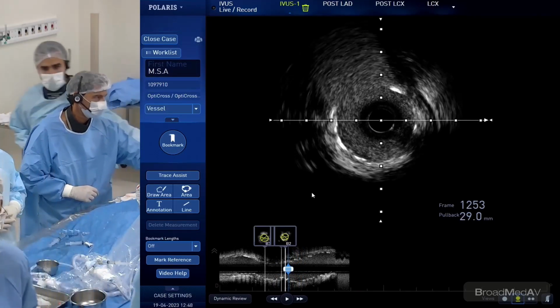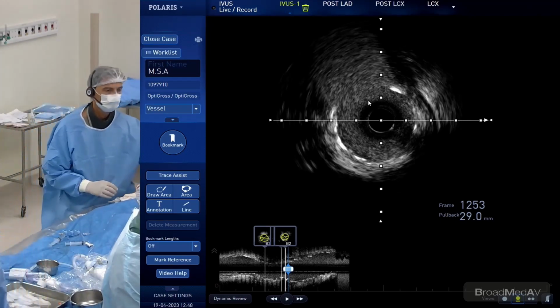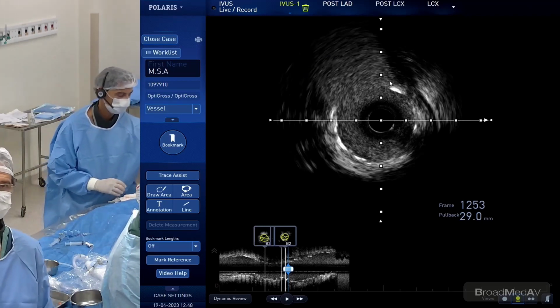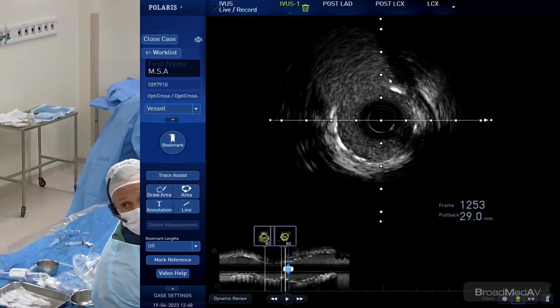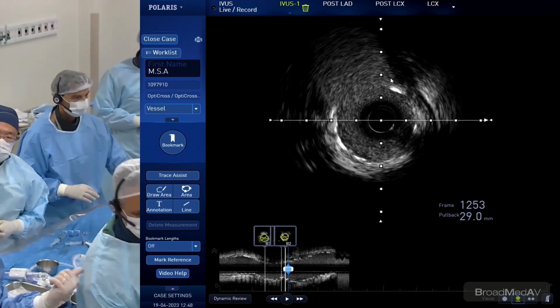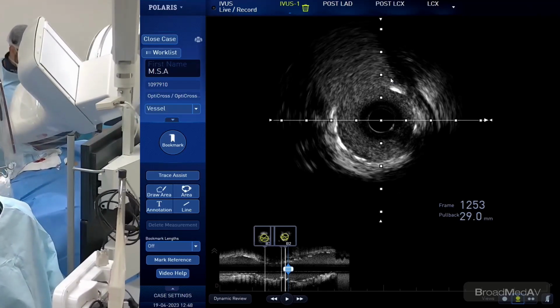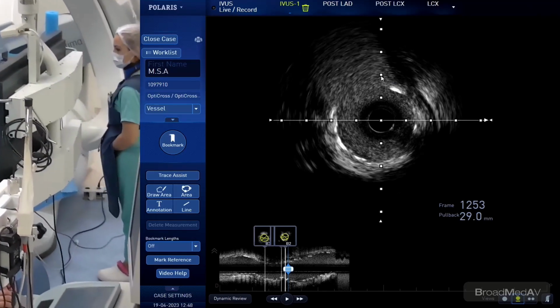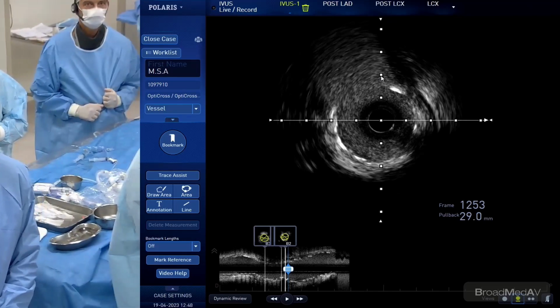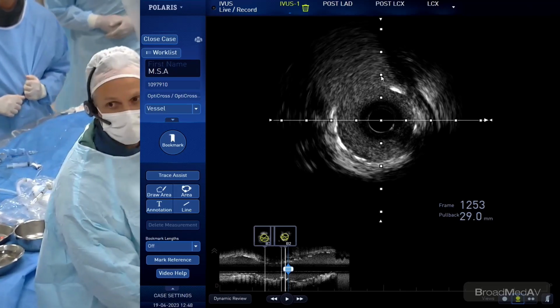Come a little closer so you appear. Yeah, look at the circumflex opening here, from 10 to 12. Maybe you can see me here. Okay. Can you show Ricardo, please, with the camera? Okay, great. A little bit left. Little bit here. No, left. Okay, thank you. Maybe you can open a little bit more. Show all of us here.